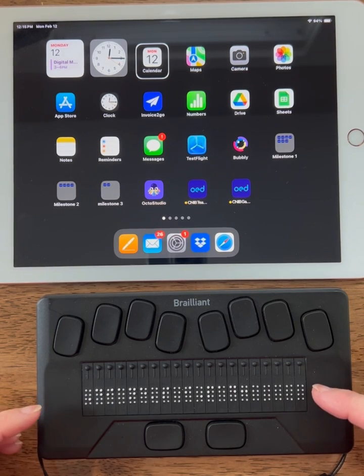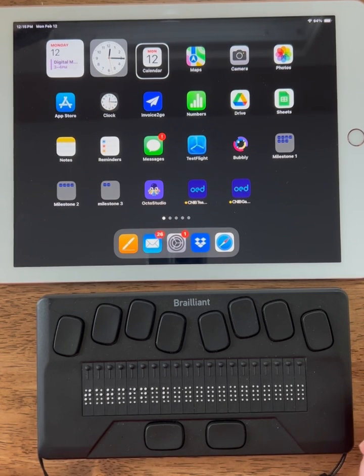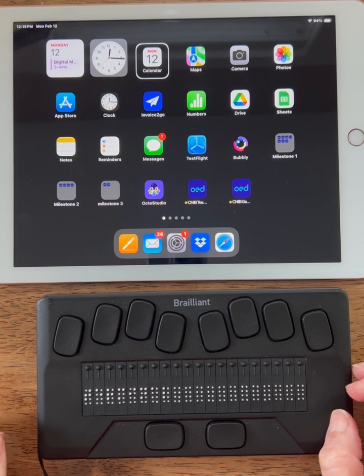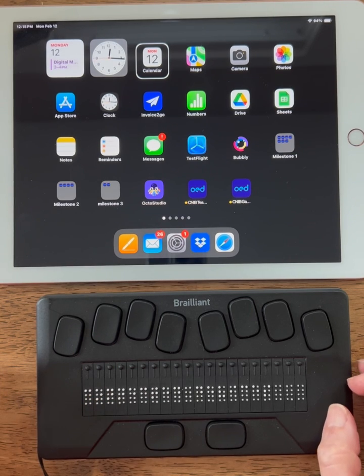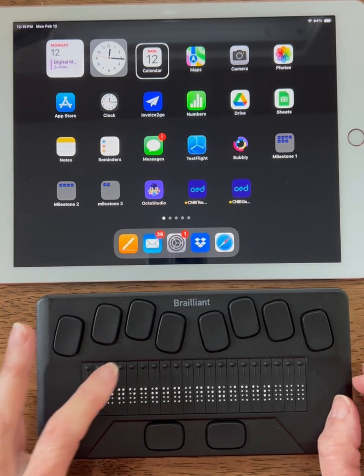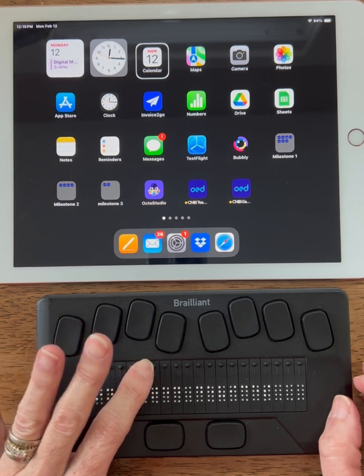It told me I'm in terminal mode and that my iPad is connected. Let's go through those steps to make sure we can navigate the iPad using my Braille display. I'm in terminal mode. I'm going to select any routing button to select terminal — it goes to connected devices. I want to select that, so I'm going to press the routing button again.